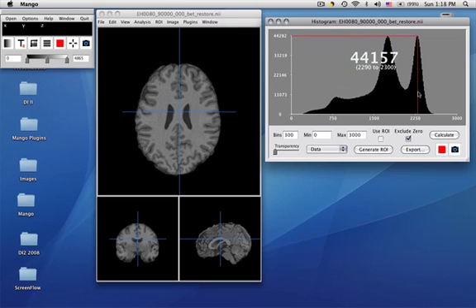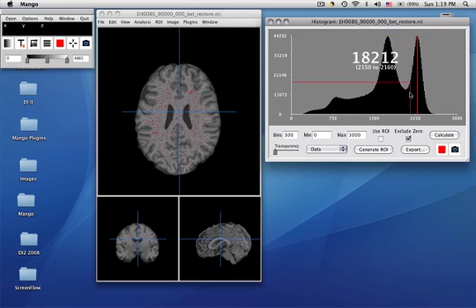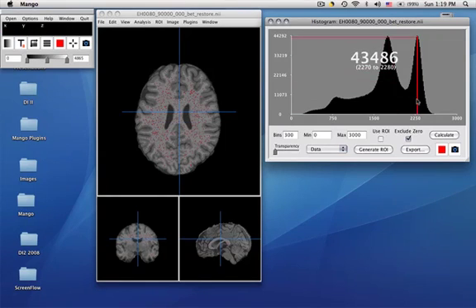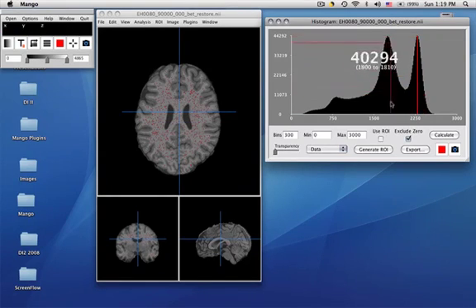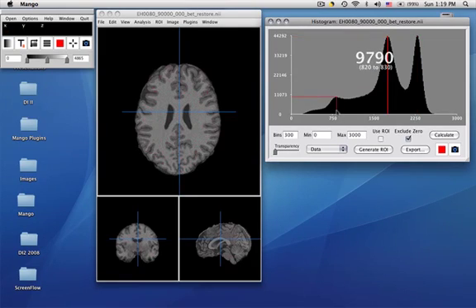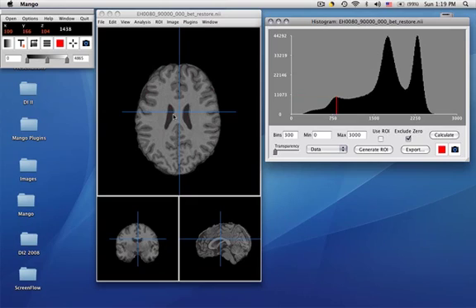If I move to one of these big distributions and click on it, I put an anchor there. And if you notice in the image, the color that I had there highlights all the pixel values that were in that range. In this case, this is a white matter distribution we assume. And if we click this, this is a gray matter distribution. And over here, this little small one seems to be mostly in CSF.